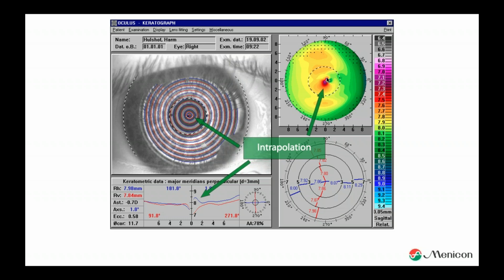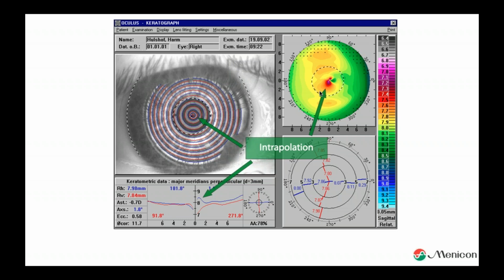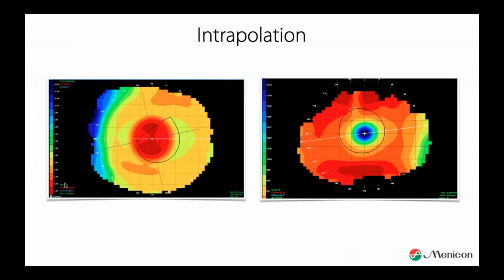And if you realize that, it's funny that we still use K readings when we use a topographer. Because in fact, we are not measuring the K readings, they are simulated. And you will see it in your topographer as well. You can probably see it quite clearly: it says Sim K, simulated K readings. The topographer is screaming to you, I just calculated, I didn't measure it. The topographer is very good at measuring the periphery of the eye.